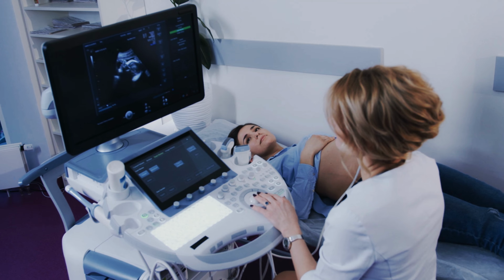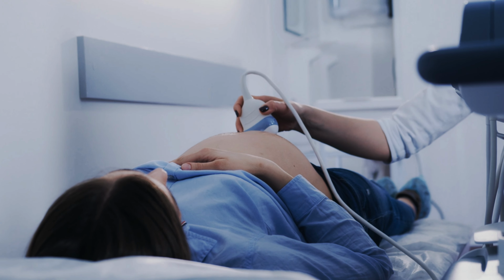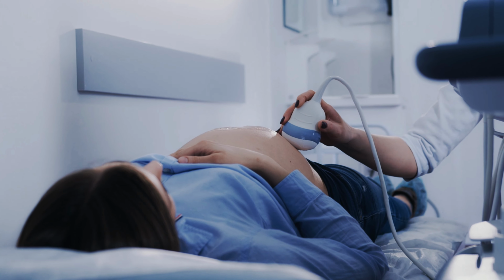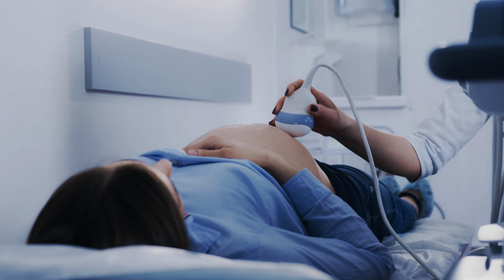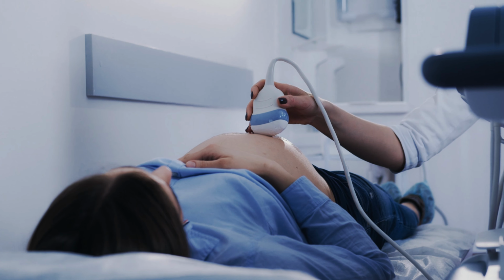Image creation. The ultrasound machine's CPU processes these echoes to form a real-time visual image, which can be seen on the screen. Differences in echo intensity, brightness on the screen, provide information about tissue density and structure.